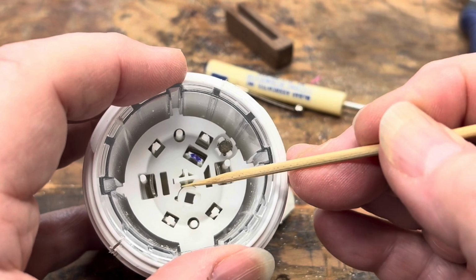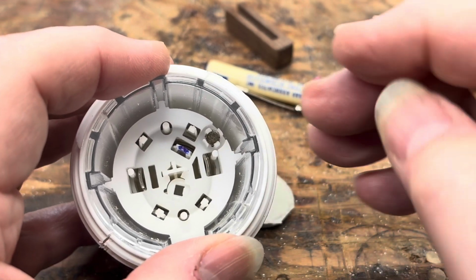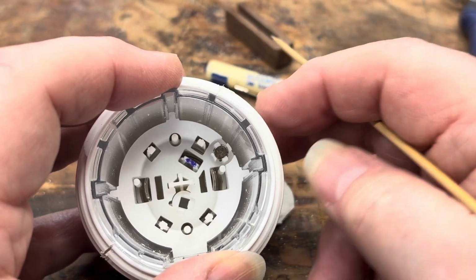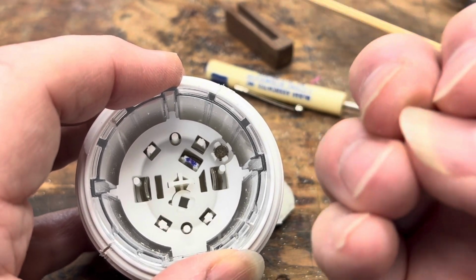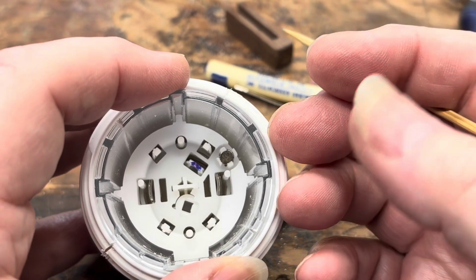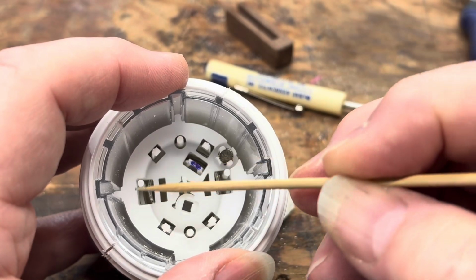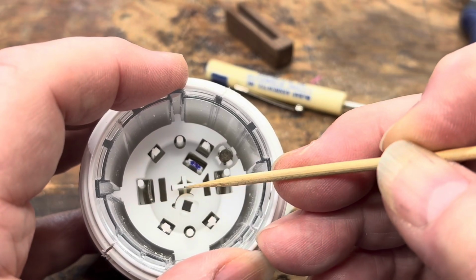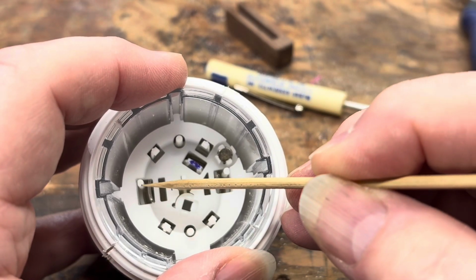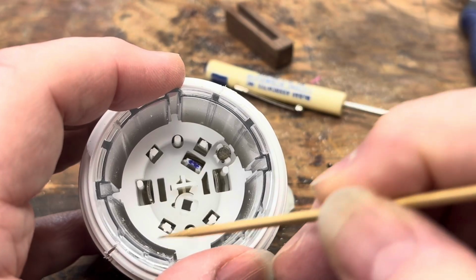Then as this 3-4 comes out towards the patient, that hook coming from cup 2 catches on cup 4, which arrests cup 4's motion, and then releases the spring between 3 and 4. So now 4 is going to withdraw from 3. It's going to let go of all these fingers that are holding the device.